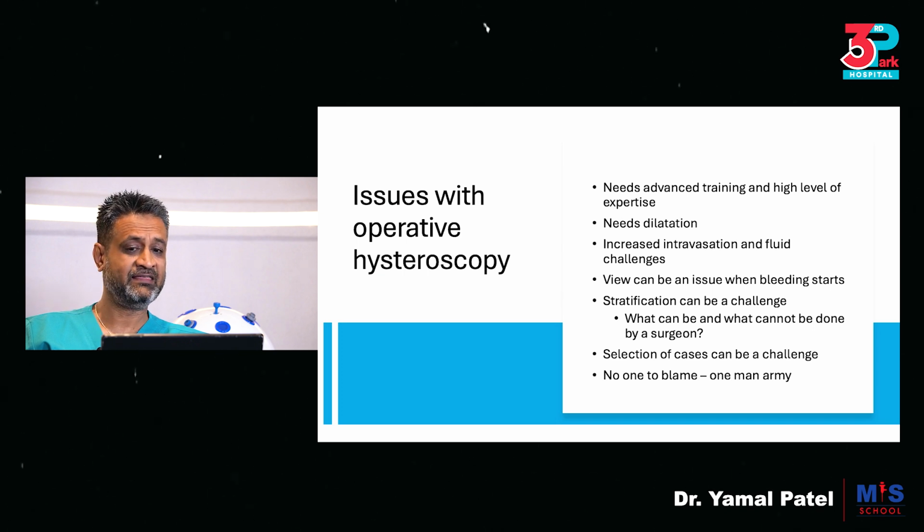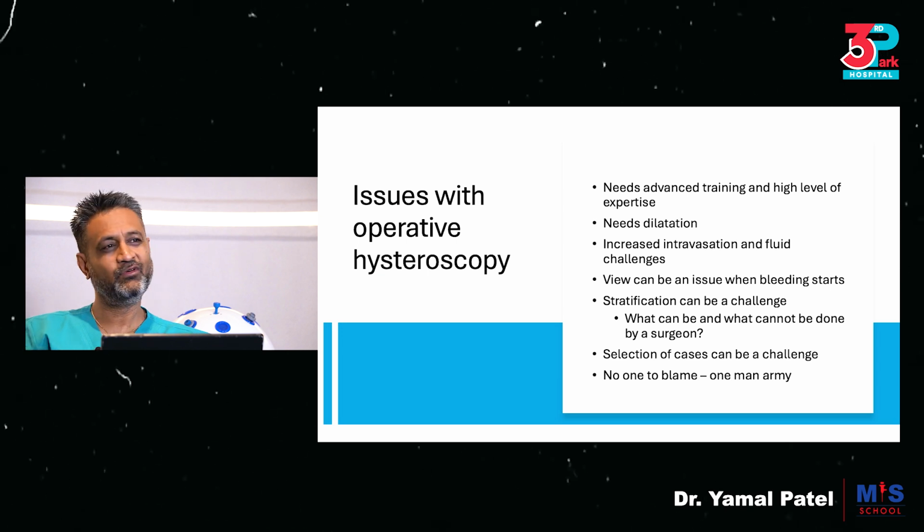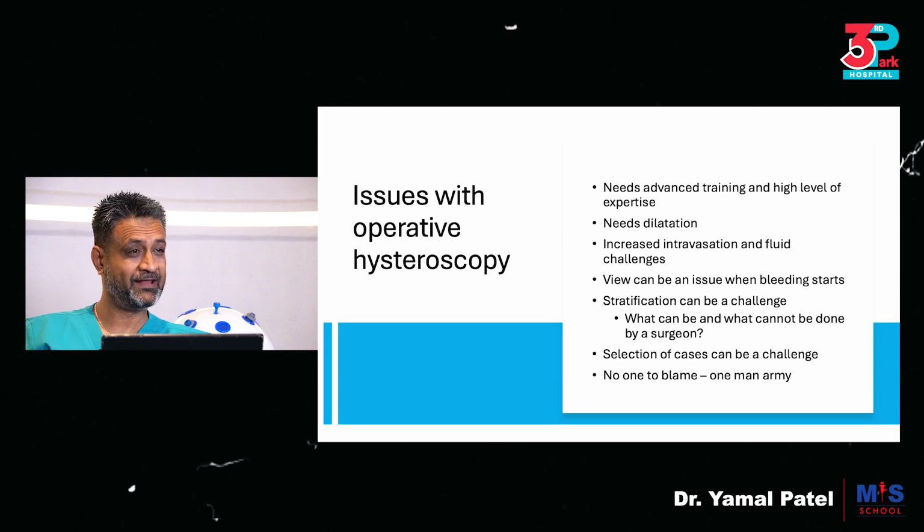We have to understand that in operative hysteroscopy and in all hysteroscopy procedures, there's no one you can blame. It's a one-man army. You are the camera person, and the operative surgeon, and the one doing the whole procedure.